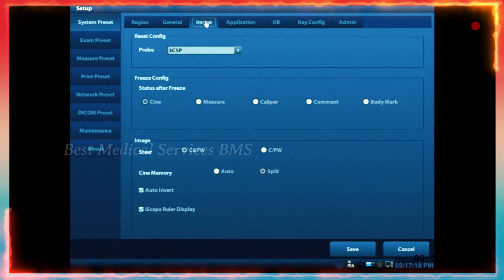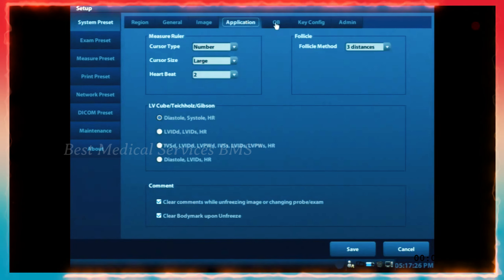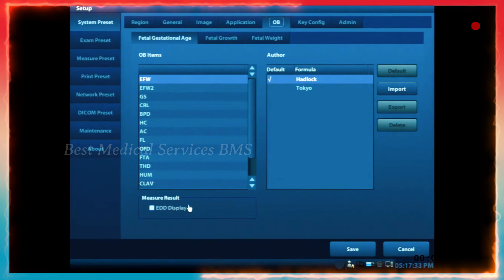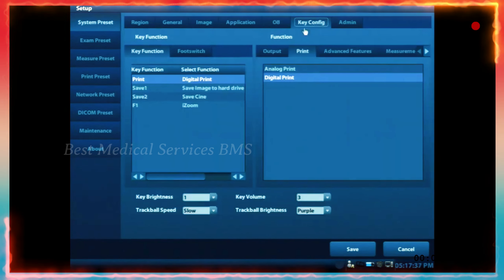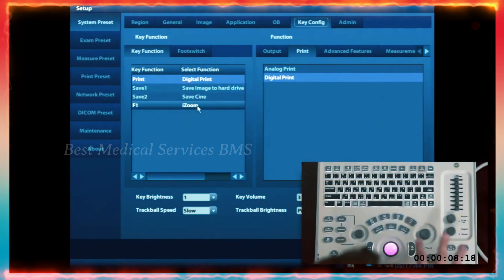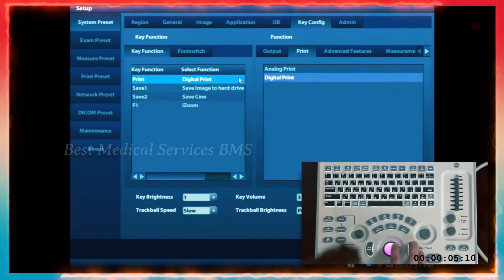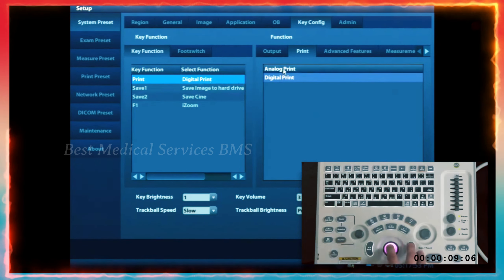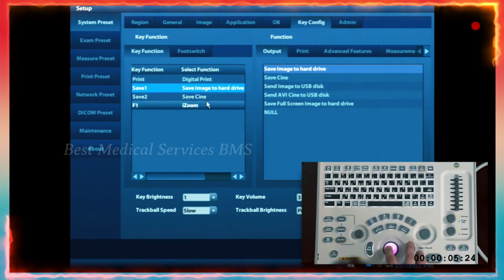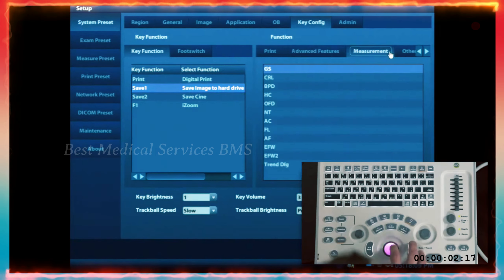The image tab has parameters you can change when imaging based on your preferences. Under the OB tab, you may want to have EDD selected for OB scanning. Under the key configuration tab, you see the print button as well as save one and save two and your F1 buttons on the console. You can select those and change what they control. If you have an analog printer, you can change to analog print on the print option. If you'd like your save buttons to do something other than save a still image or cine clip, you can explore those options.